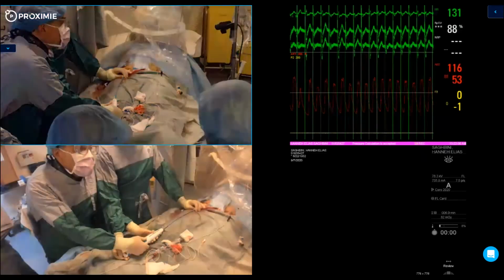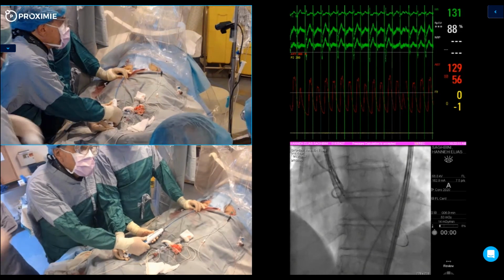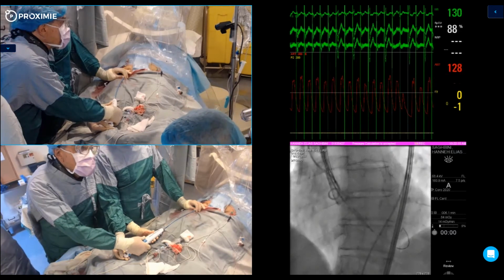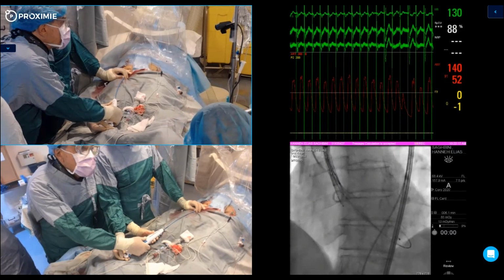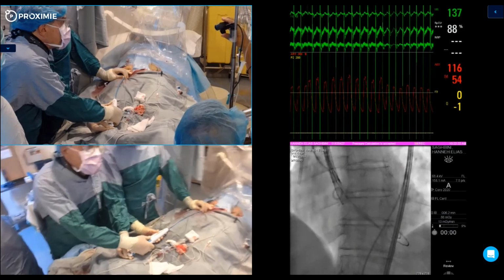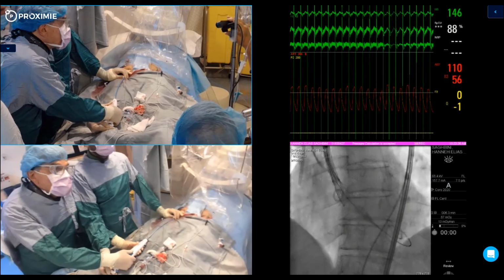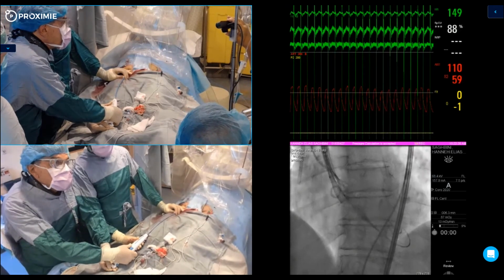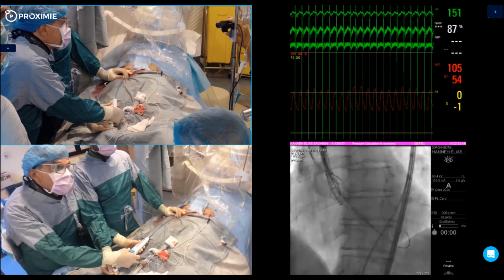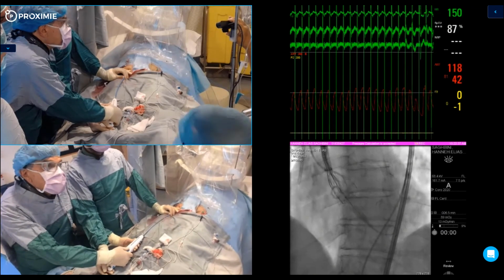Okay, I think it's not bad. Okay, keep going. One turn. One turn. One turn. Can we pace at 150, please? Okay. Go for one turn. Go all the way. Go, go, go.